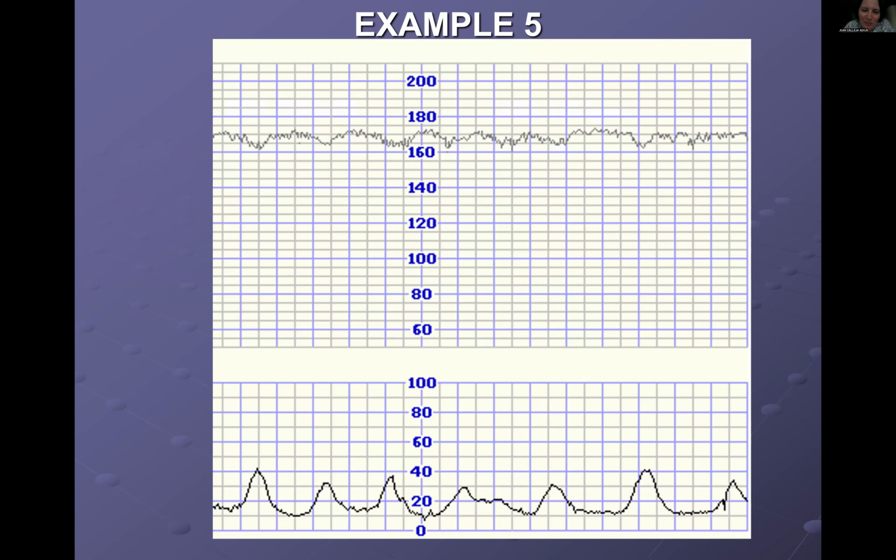So the contractions, what about the contractions, please? From here I see 3 to 4 contractions in 10 minutes, approximately. We can't see the full 10 minutes, but just looking here, there are at least 4, which is understandable. I mean, she's being augmented. So contraction-wise, it's at least 4 every 10 minutes.